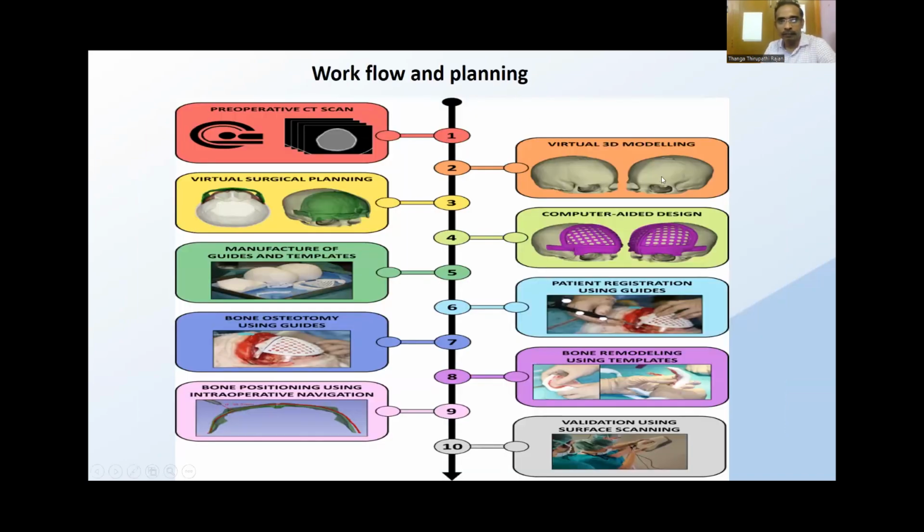So this is the workflow pattern we adopted. It's exactly from that paper only. First you do a pre-op CT, virtual 3D modeling, virtual surgical planning. We cut down the design because of the cost.